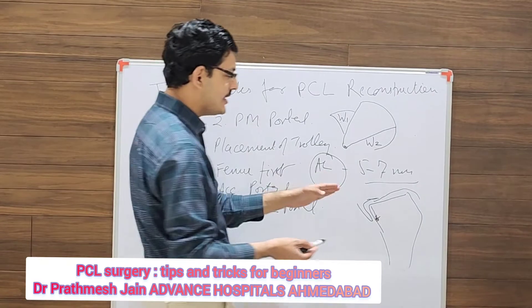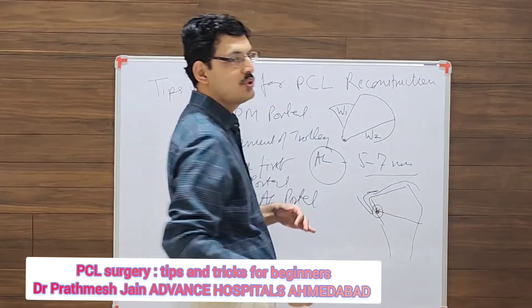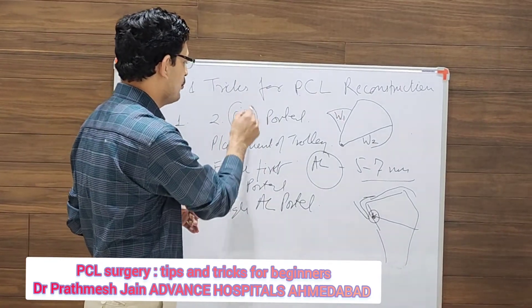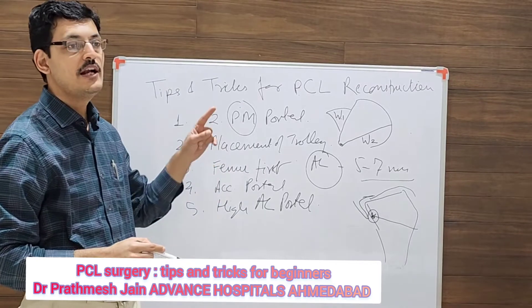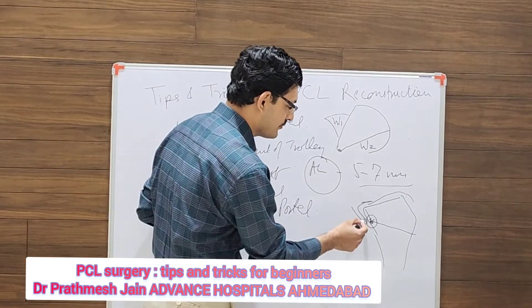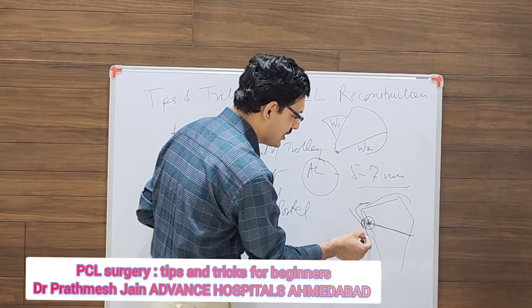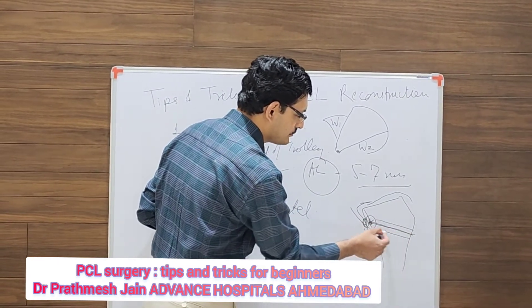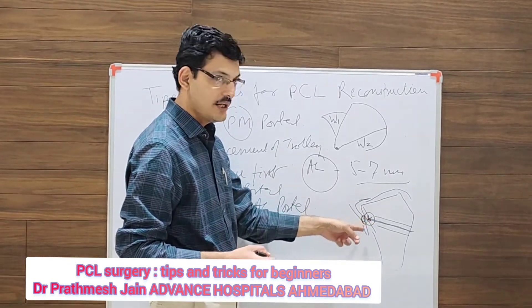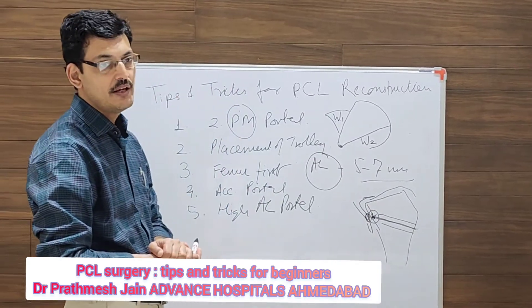This is actually a risky part. Whenever you are drilling here, you need to be very careful. I recommend viewing from the superior posteromedial portal during this step and keeping a protector posteriorly. When you are inserting the Beath pin, protect it posteriorly and then over-drill. Keeping a posterior portal and a protector for the Beath pin is very important.